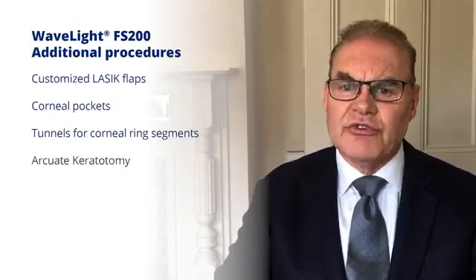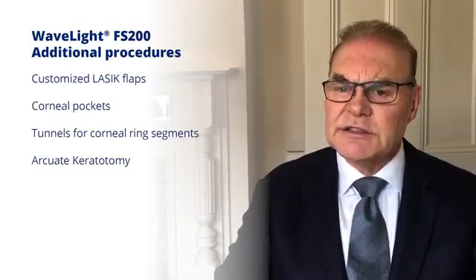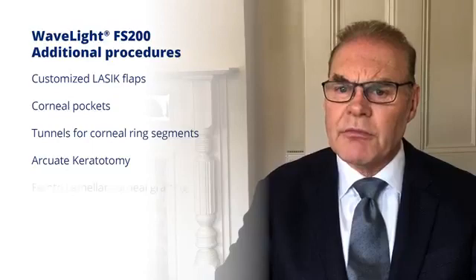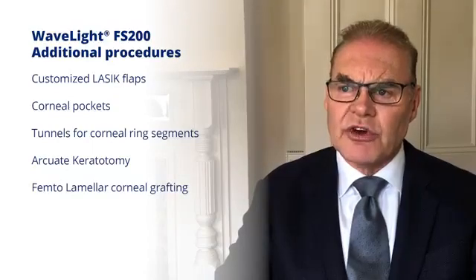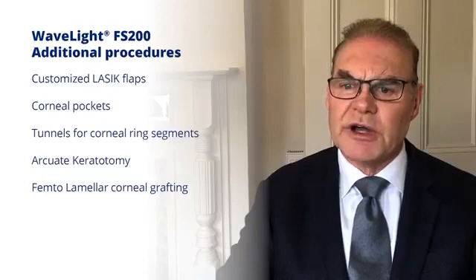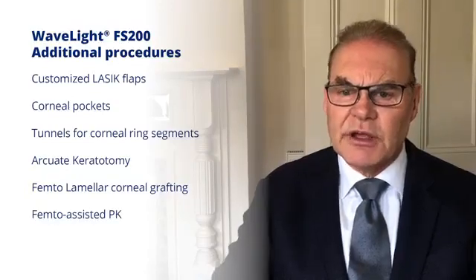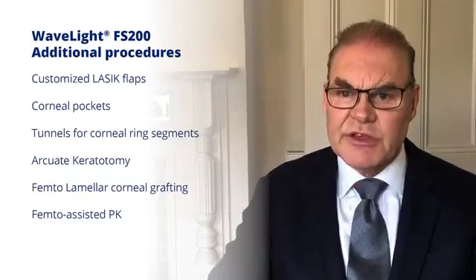It can be used for arcuate corneal cuts to alter astigmatism. And it can be used in corneal grafting. It can be used for full thickness corneal grafting with modified peripheral shapes. And it can be used for femtolamellar grafting. So let's have a look at some of these options that we've got.